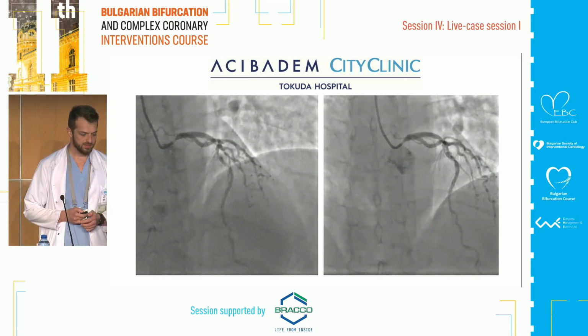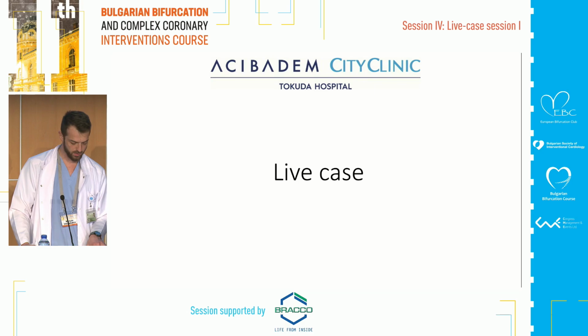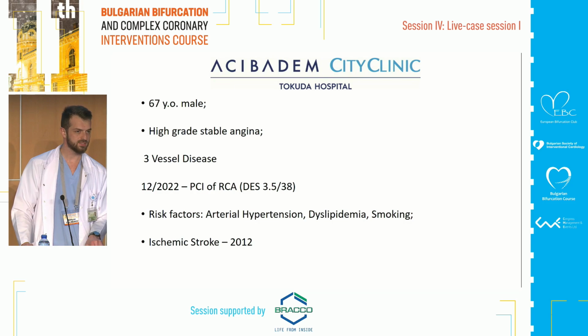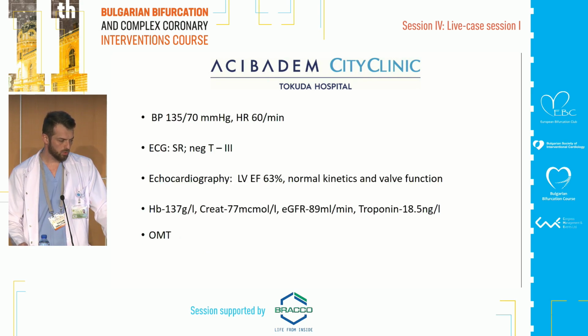Can we switch to the next case? The next case will be in the second cath lab, and Professor Vasilev with Dr. Nenov will work on it. It's about a 67-year-old male with high-grade stable angina and known three-vessel disease. A month ago, PCI of the right was performed. The patient also has an ischemic stroke in the past. No significant ST-T changes, no severe valve lesions, normal echo.